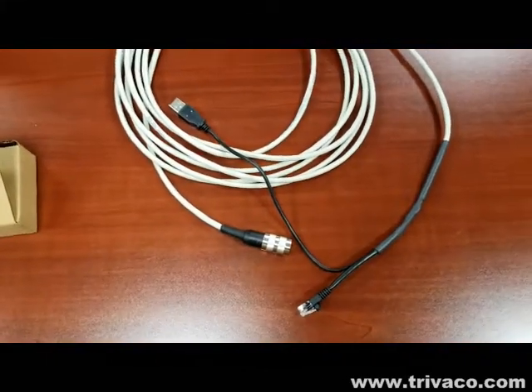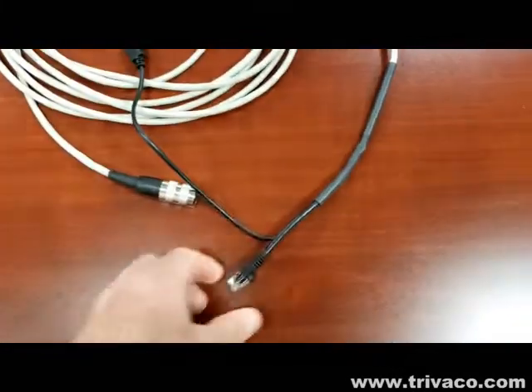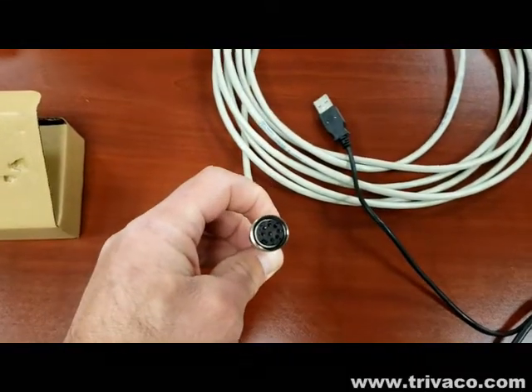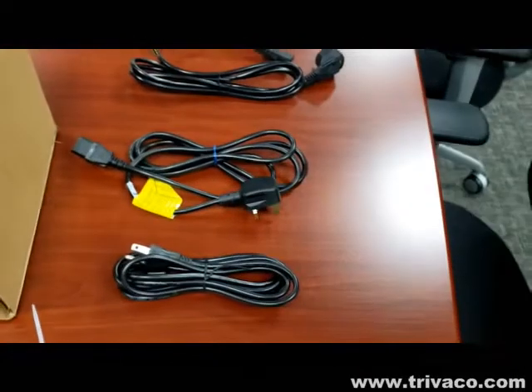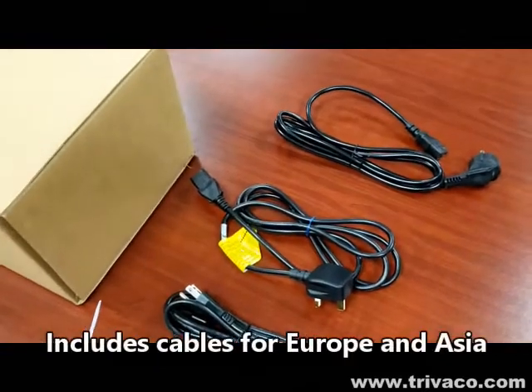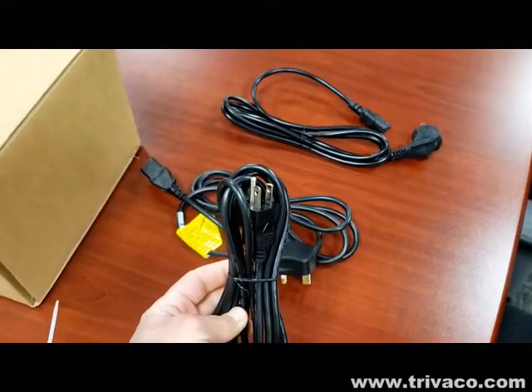Also included are cables for attachment via USB to the computer, ethernet to the computer, and a proprietary connector to the back of the imager. You'll also receive multiple power adapters, two of which most likely will not be necessary — only the 110-volt AC adapter.